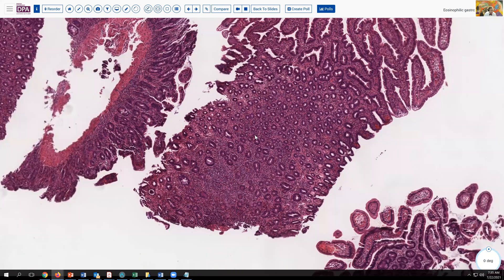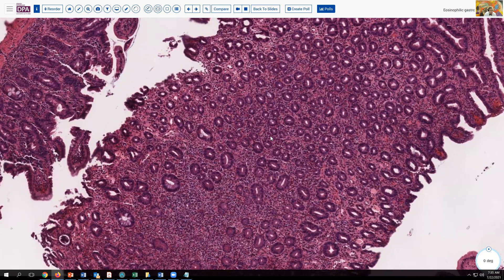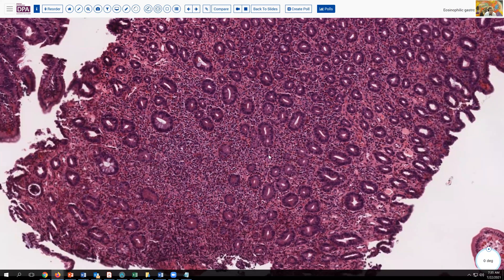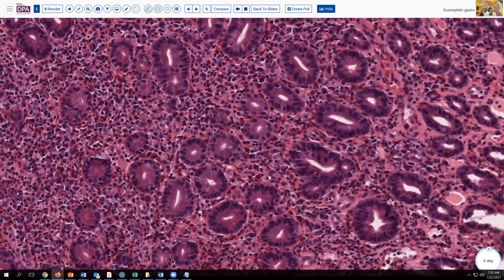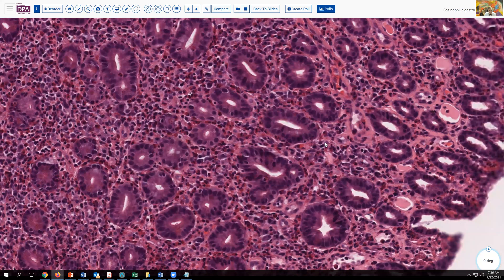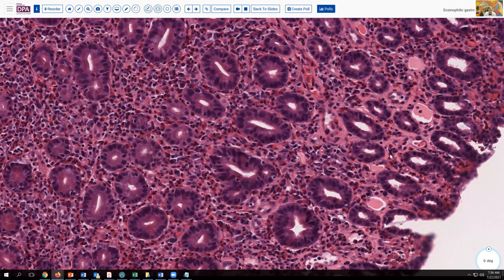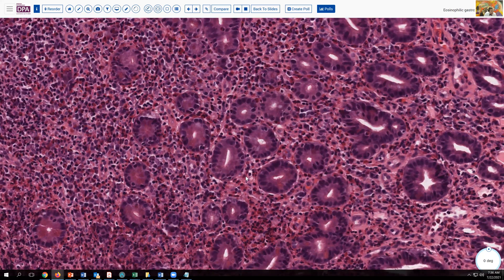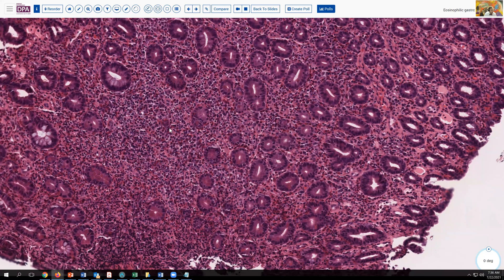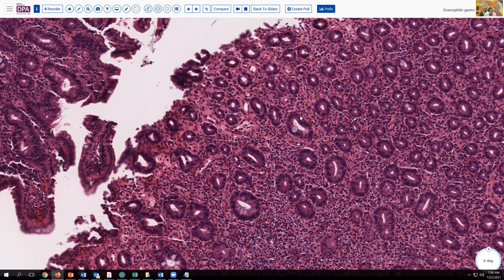Note how the glands get smaller and so forth. Additionally, as we look at this here, we see that there is a bit more eosinophilia than usual. Looking down here, we can see that there are quite a few eosinophils in the stroma. We encounter eosinophils in the lamina propria in the bowel very frequently, but they're usually modest in number, not associated with ulceration or erosion, and they usually don't invade into the glandular or epithelial component, which we see in several instances here.